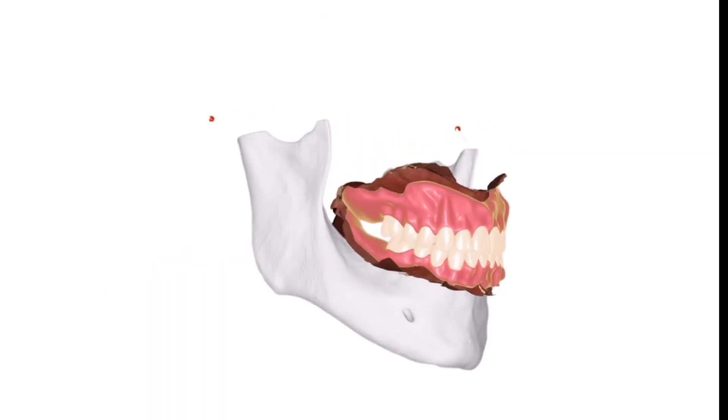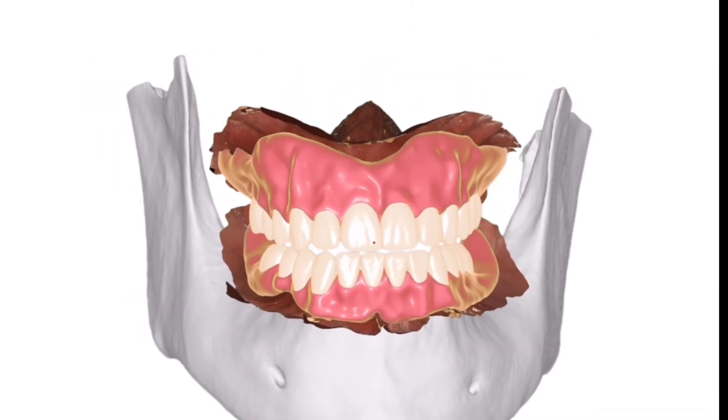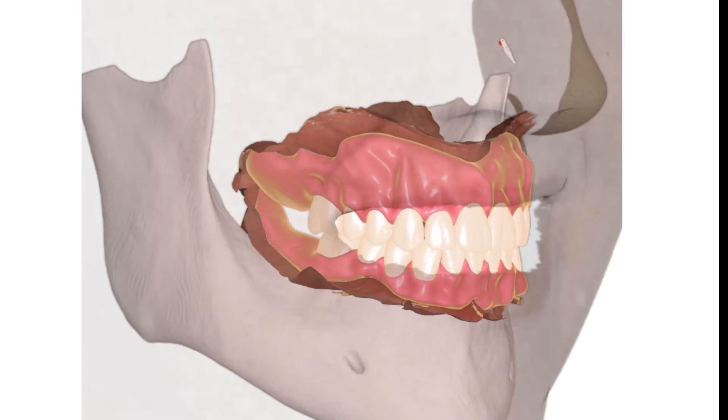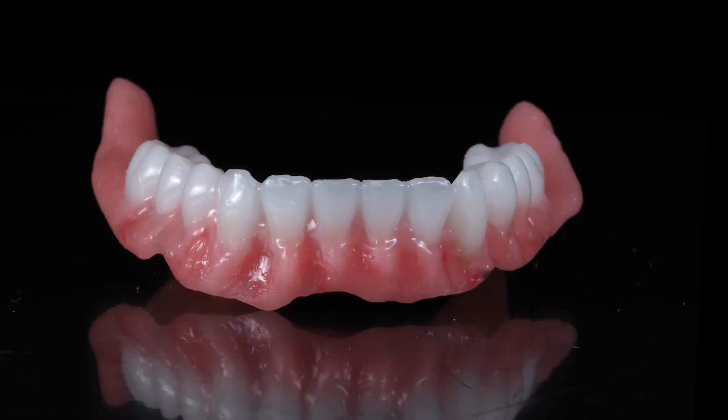So now the face, the jaws, the CBCT DICOM data set, along with ModJaw for 4D jaw motion patient-specific movement are all combined to design 3D printed dentures. These are absolutely beautiful.